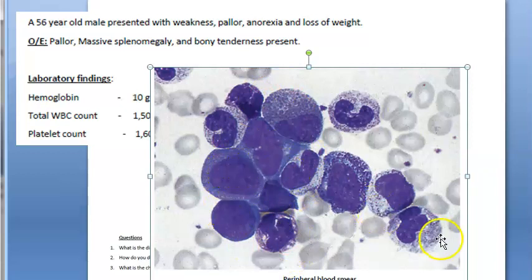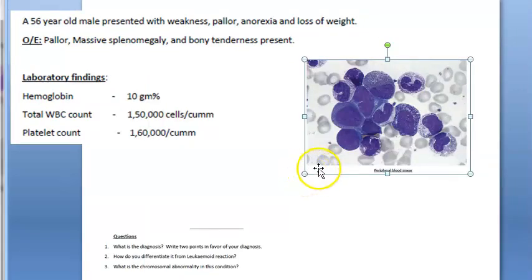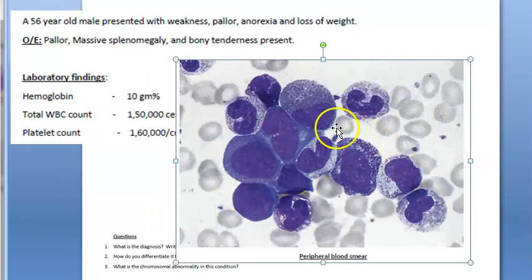these are not lymphoid, these are all myeloid cells. What do you say? A myelocyte probably. So what all makes the neutrophil, you know that, right? A promyelocyte becomes a myelocyte, metamyelocyte, band form, then neutrophil. These look like band forms. Based on the color of the granules, you'll have to say whether it is a band form or an eosinophil. This actually looks like a band form more to me than an eosinophil.